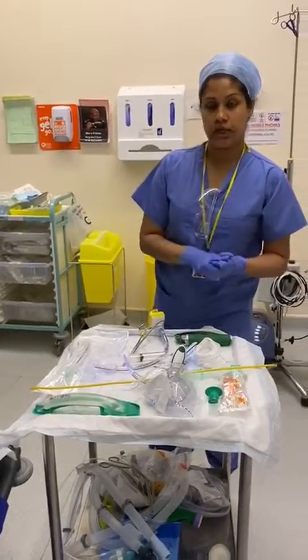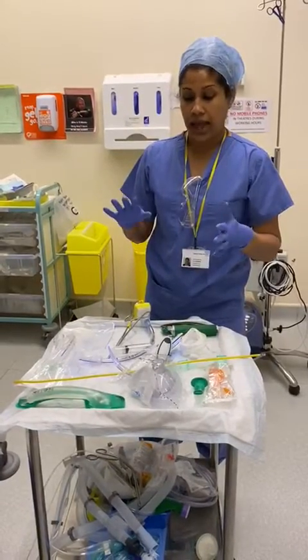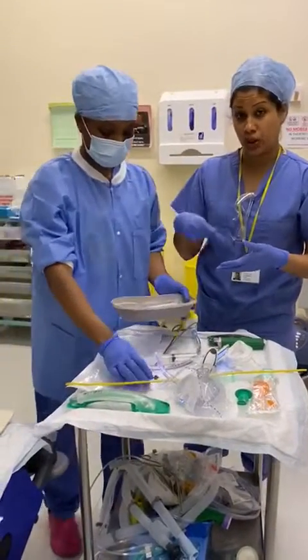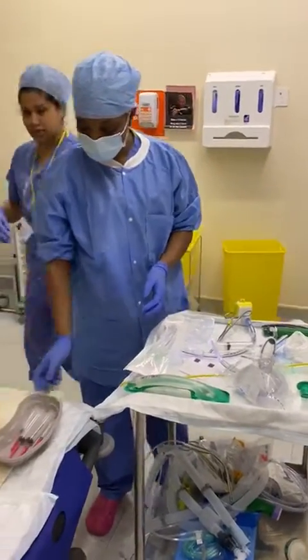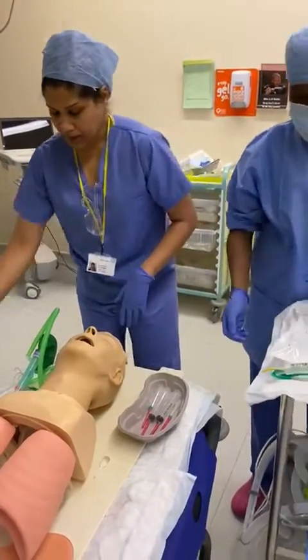The next thing you're going to make sure is that you've got your intubation drugs drawn up, and that you've agreed on what kind of dosing you're going to give prior to entering the room that the patient is in. Right. Come into the room, make sure that you've got access and that it's working properly.